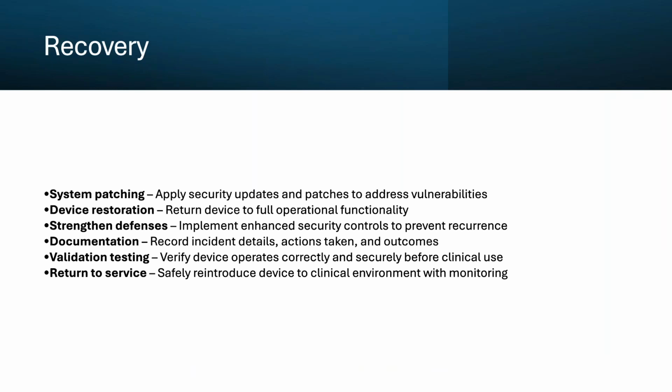Documentation is essential throughout the entire recovery process. We record every detail that was compromised, what actions were taken, what patches were applied, what testing was performed. This creates an audit trail for regulatory bodies and helps us learn from these incidents.